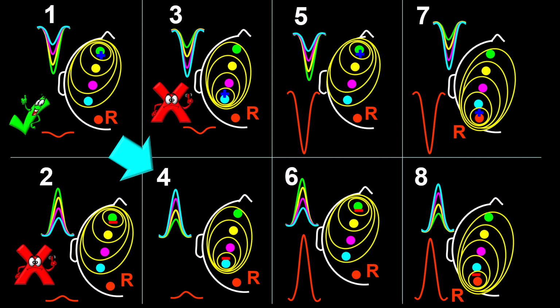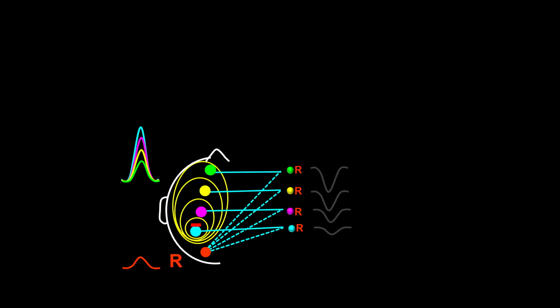In option 4, we are dealing with an occipital polar negative field being referred to a minimal negativity represented in the scalp at the time of the recording. This frame represents an isopotential map corresponding to option 4 and the waves in question.